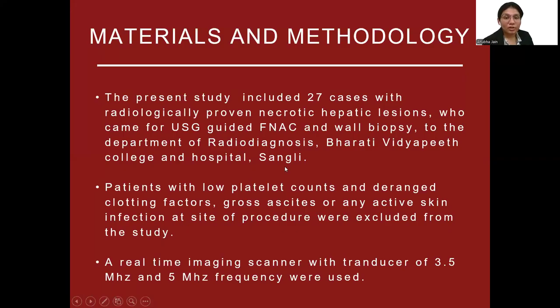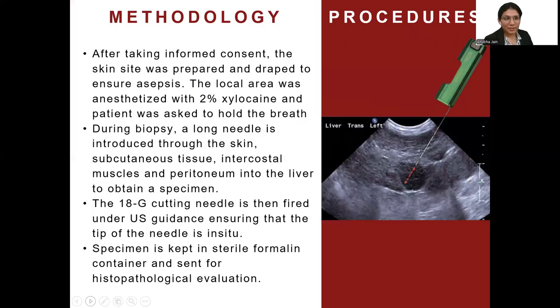Study includes 27 cases with radiologically proven necrotic hepatic lesions who came to our department. Patients with low platelet counts and deranged clotting factors or gross ascites or any active skin infections at the site of the procedure were excluded from the study. A real-time imaging was done under USG guidance. After taking informed consent, ensuring asepsis, anesthesia was given.